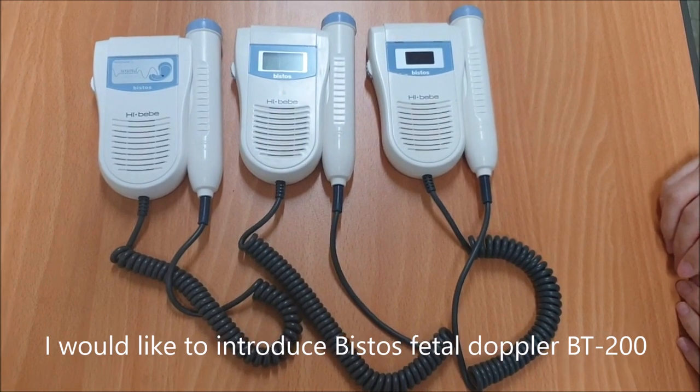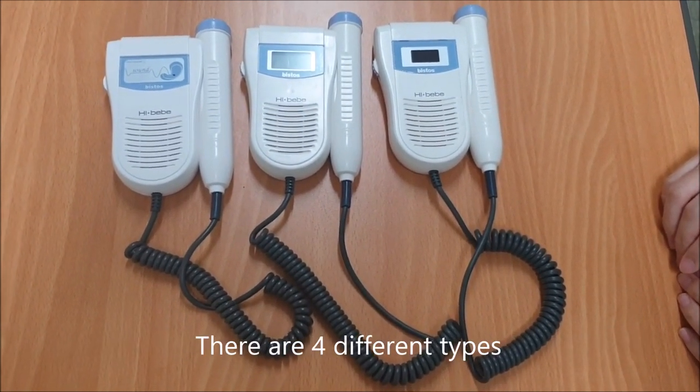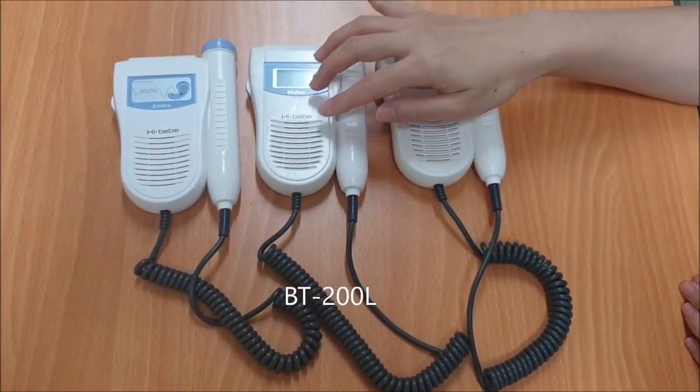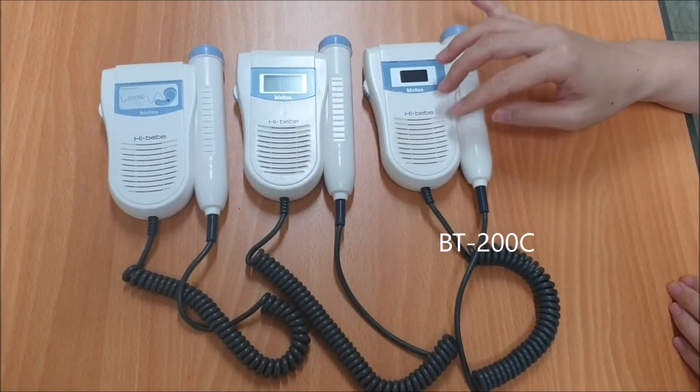I'd like to introduce the Vistospital Doppler BT-200. There are four different types: BT-200S, BT-200L, BT-200T, and BT-200C.